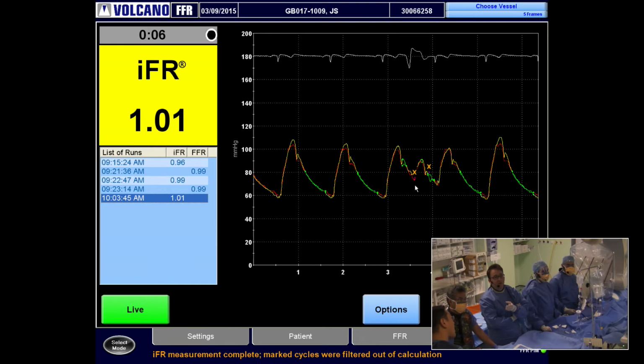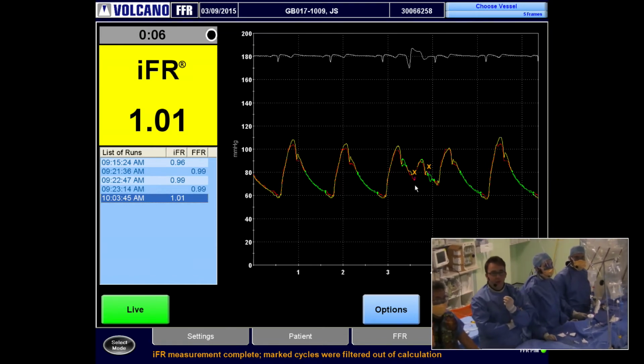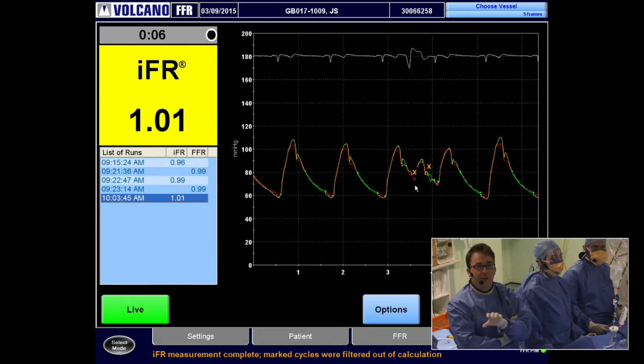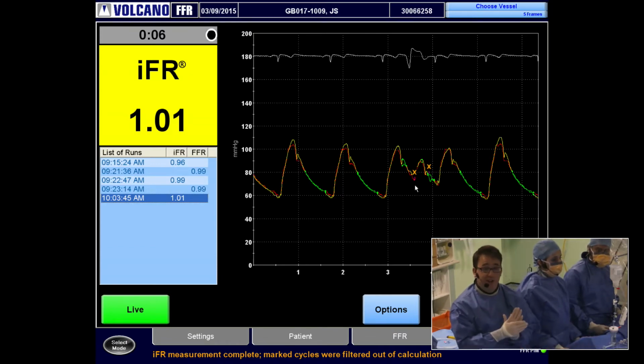And previously I've always had to explain that the software is very, very good, and it's able to extract out the ectopic beats from the non-ectopic beats if it feels that it can't use that in the measurement. And here you can see that these beats with the red crosses on have been filtered out for the calculation of the IFR value. So we're really starting to use these technologies now to build on the technologies of the past, which just effectively averaged over all of these things, now to extract out beats which are less good from those which are better.